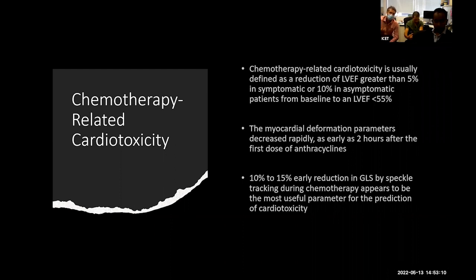And then there is some cardiology literature suggesting that the SRE, for segmental diastolic dysfunction, may actually be the most sensitive marker for ischemia. But these are single center studies done by enthusiasts in small patient numbers. So the long and short of it is, yes, you can get it, but it is a long, long way away from being validated. Thanks.